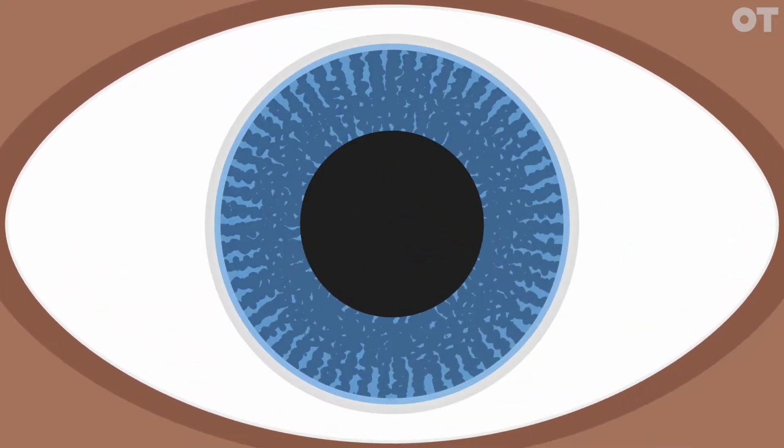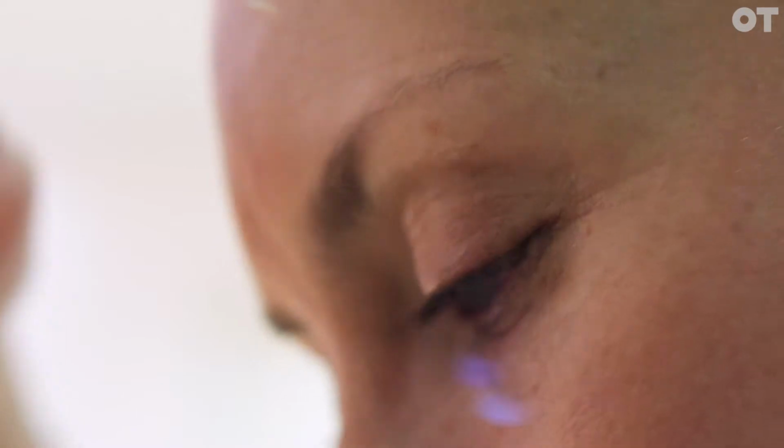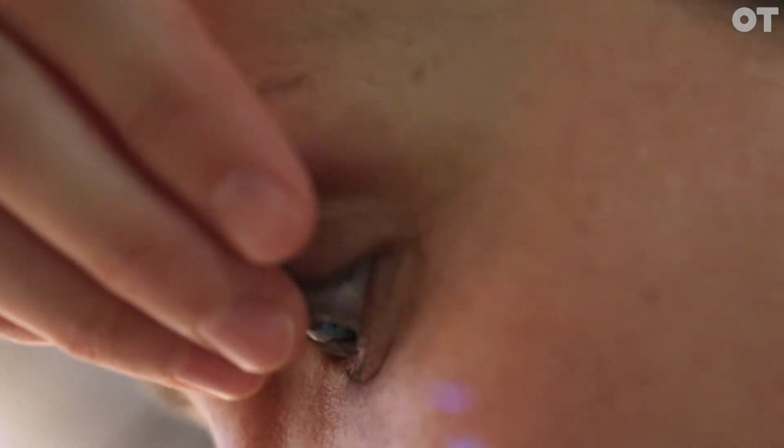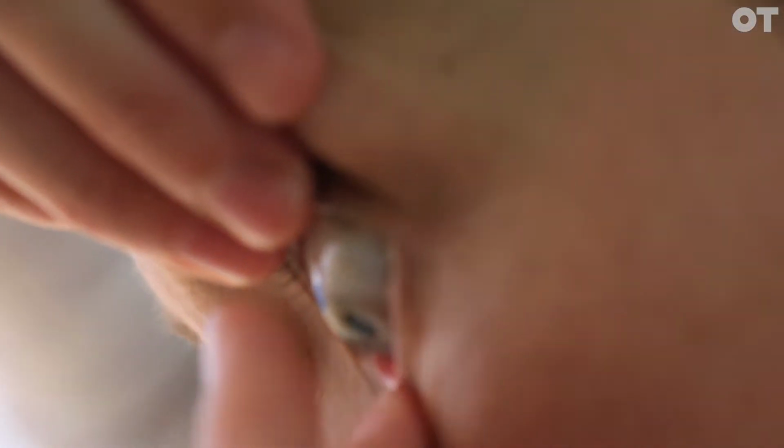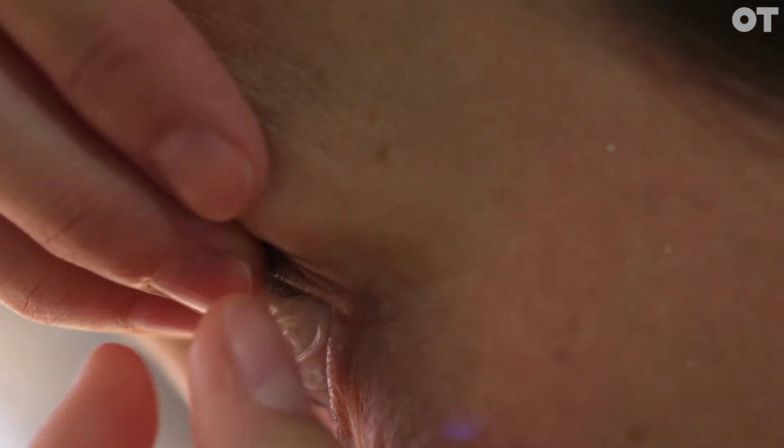Now if you've got an eye sort of more shaped like mine, it's not big, sort of wide eye, then there's no room down there to pinch the lens off the bottom of the sclera, so I go to the side. But of course, to get all the white of the eye to play with, I need to get them to look towards the nose, and now we've got all this white of the eye available. So then remembering that the lens is going to go with the eye. So if I look over there, now the lens has gone over there, so I need to get my finger right into the corner, drag the lens across, thumb's the backstop, and a little bit of pressure to pinch the lens away.